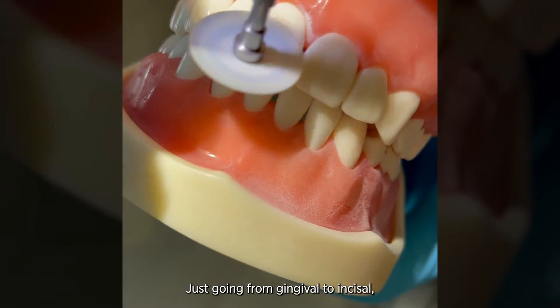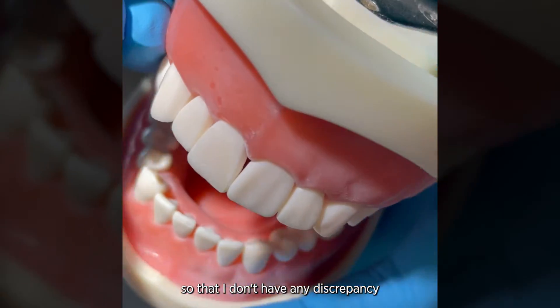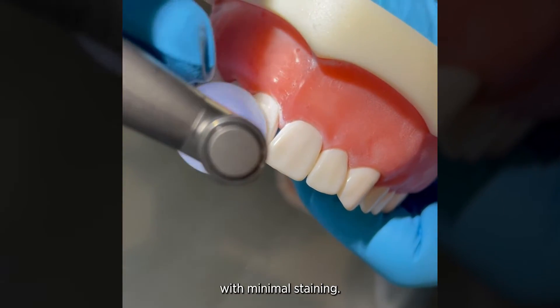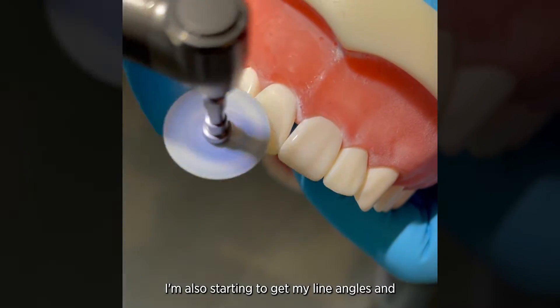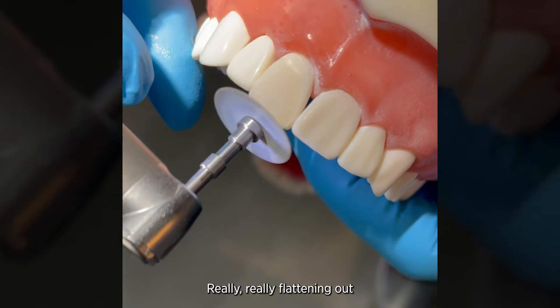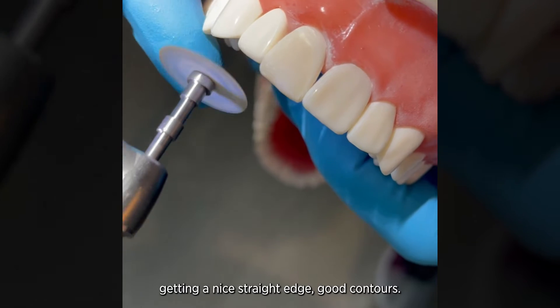I'm going from gingival to incisal, really getting where the restoration meets the tooth so that I don't have any discrepancy with that margin. That's going to help give me a nice long-lasting restoration with minimal staining. I'm also starting to get my line angles, making sure everything is nice and flat and smooth, really flattening out that incisal edge, getting a nice straight edge and good contours.